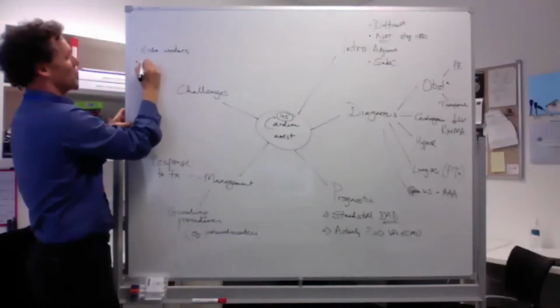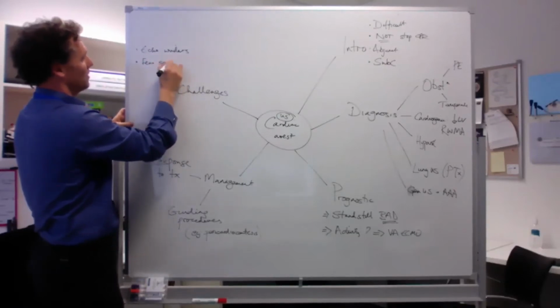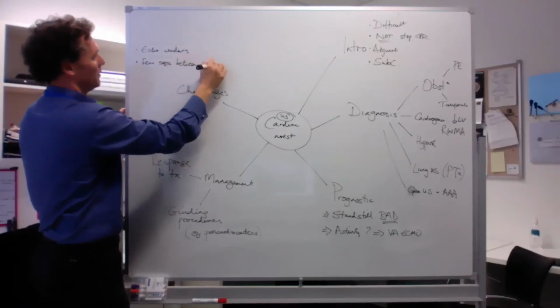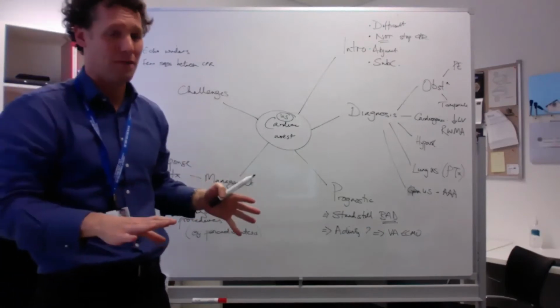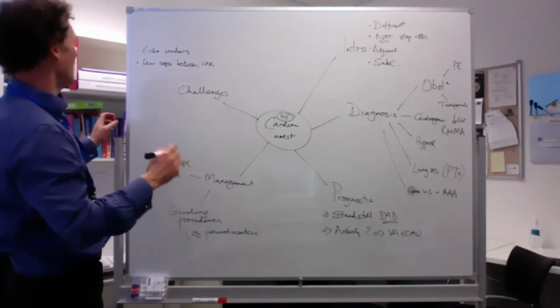Echo windows, you've got maybe a few seconds between CPR. I find it really hard to get any kind of interpretable view at all when they're doing chest compressions. You're only doing it between CPR.